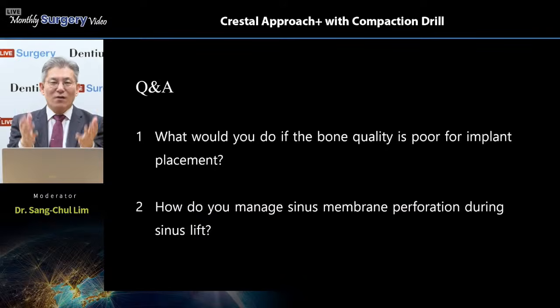However, if perforated areas still remain on the sinus membrane, we have to cover them with collagen membrane, collagen graft, or some collagen sponge, and then put the graft materials in again. The next step is the same as a normal lateral approach case, right? So depending on the procedure, there are different approach methods to overcome it.